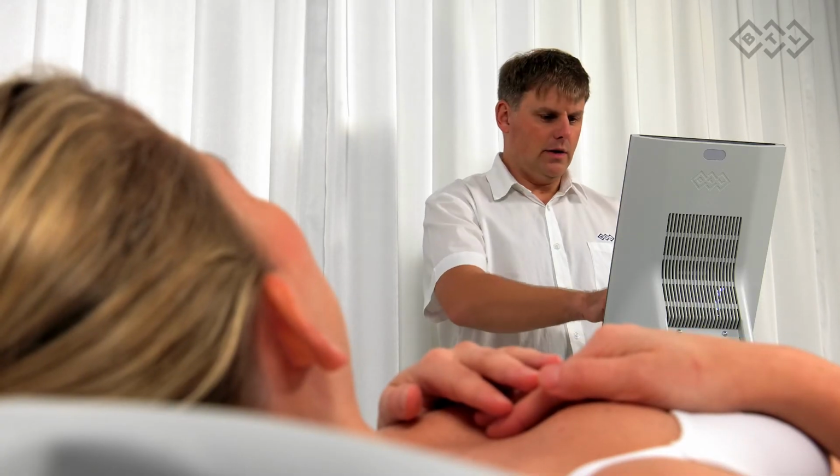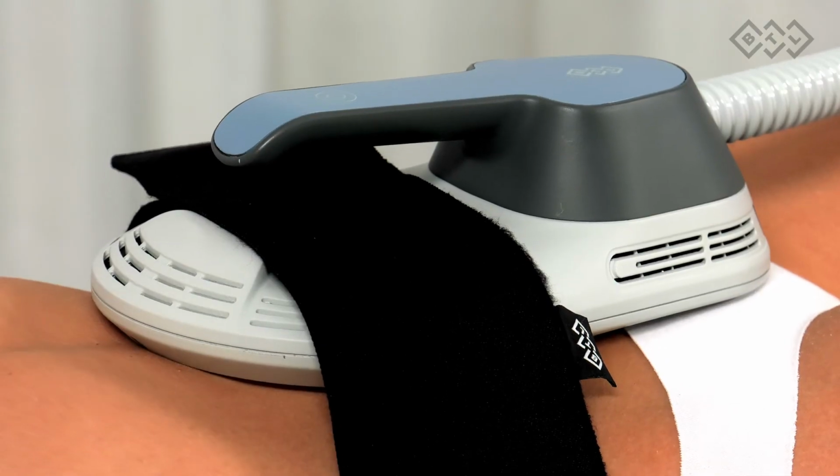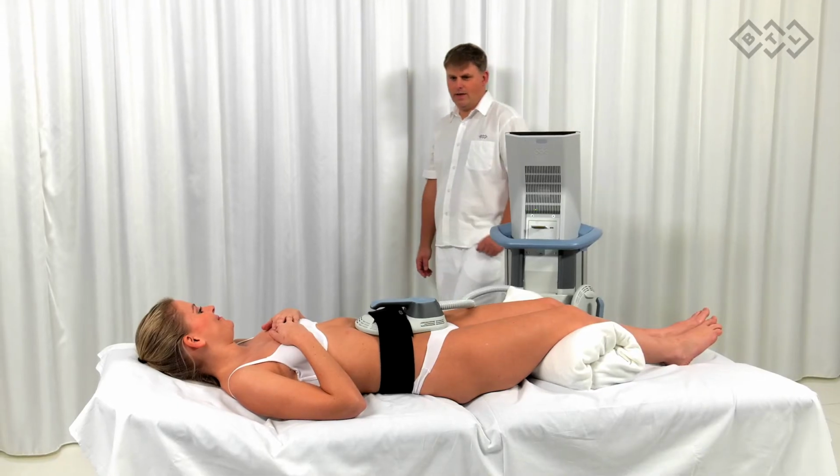Lower the intensity temporarily if the patient reports discomfort. There should be no pain. Try to increase the power back to original levels if the patient can later tolerate a higher intensity.